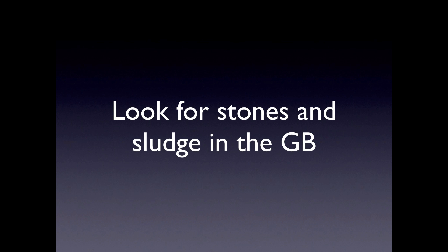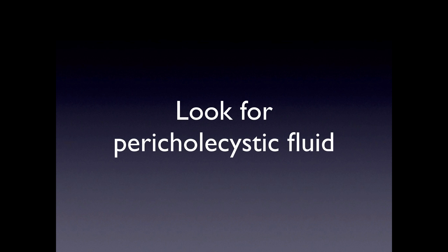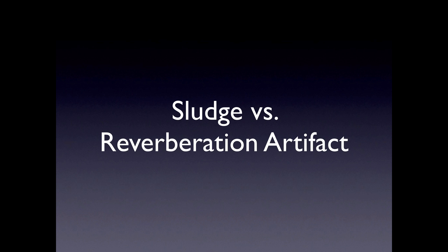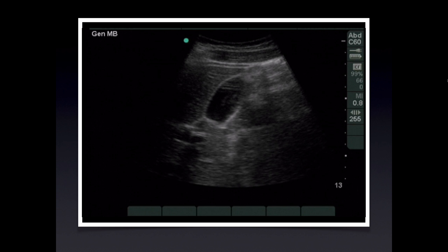While we're scanning through the gallbladder, we look for stones and sludge within it while looking for pericholecystic fluid around it. One potential pitfall is mistaking reverberation artifact for sludge. Sludge is dependent, whereas reverberation artifact will be seen on the side of the gallbladder closest to the probe. This is a good example of a reverberation artifact — you can see it located towards the top of the gallbladder, it goes beyond the gallbladder walls, and it's not located dependently like sludge would be.